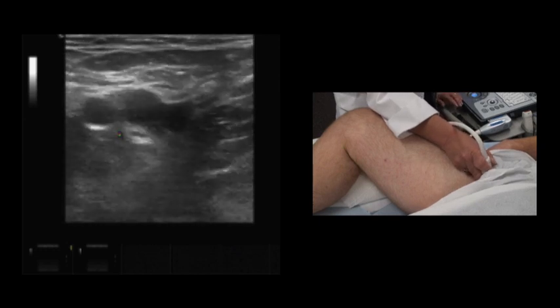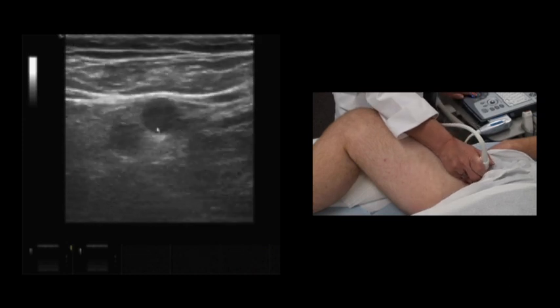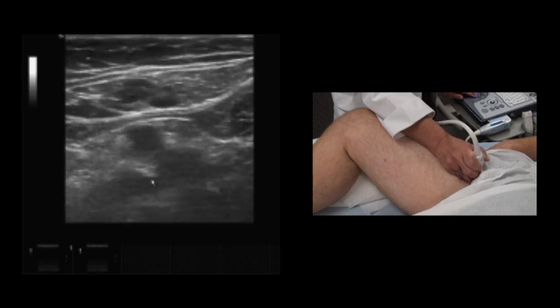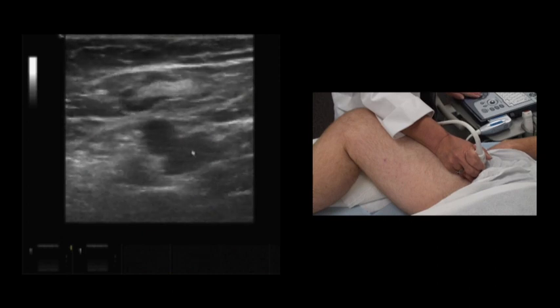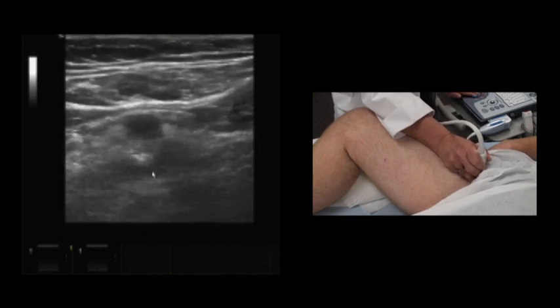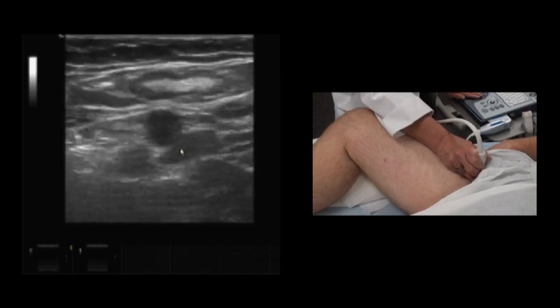We want to continually compress as we move caudally, inferiorly, and now we see the takeoff of that profunda vein. The profunda vein, the superficial femoral vein, moving back superiorly, we see again the split, profunda vein, and superficial femoral artery.